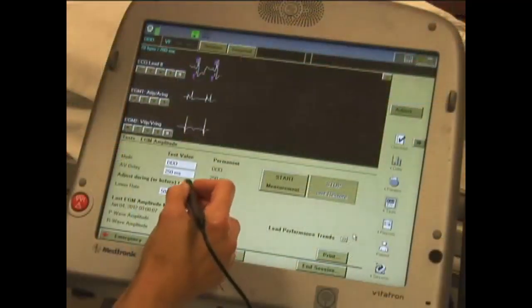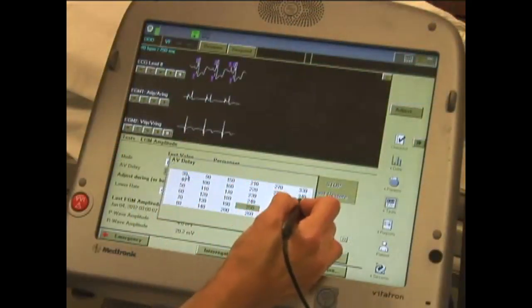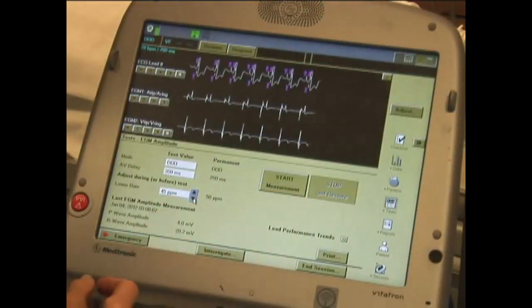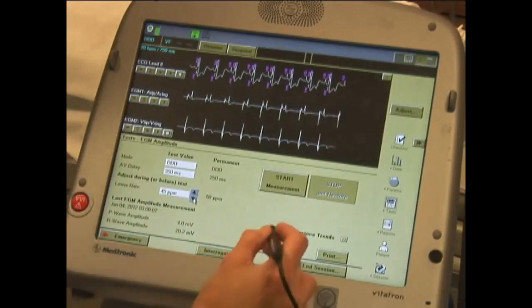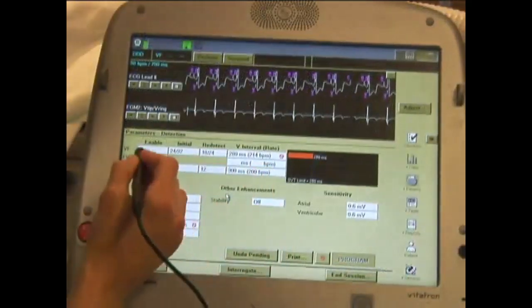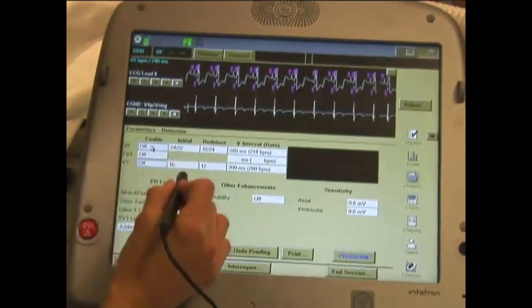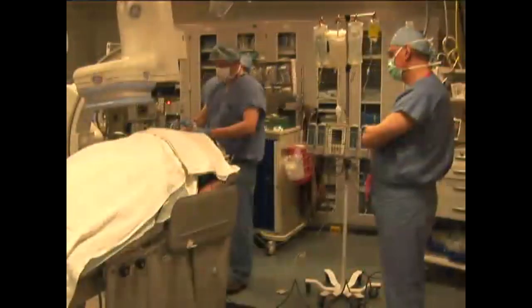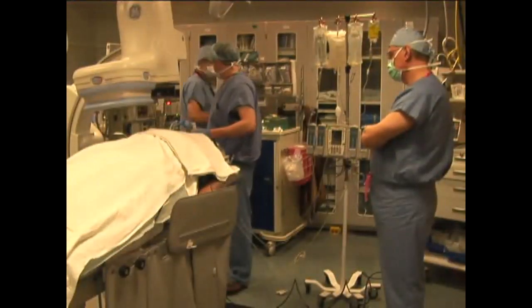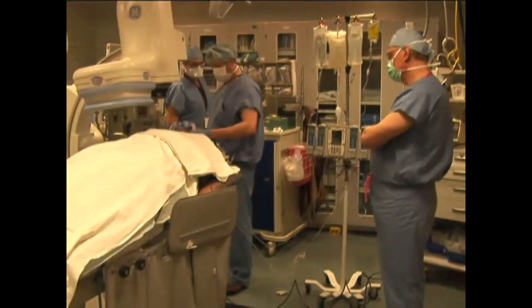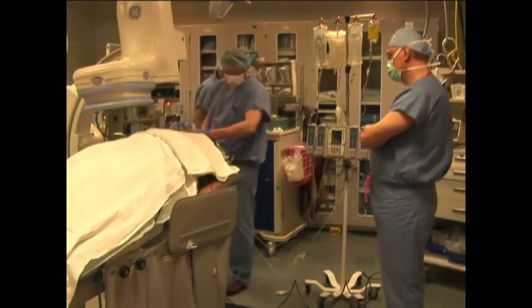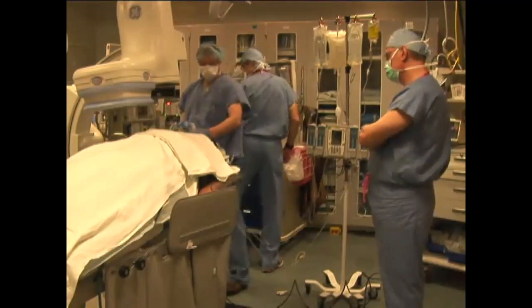The patient's ICD is interrogated. Threshold, sensing, and impedance values are checked. Tachyarrhythmic therapies are turned off. Sedation is provided with either conscious sedation or general anesthesia as per patient and physician preference.